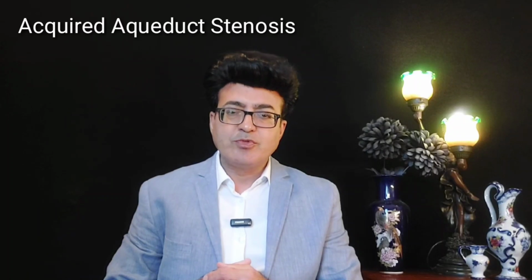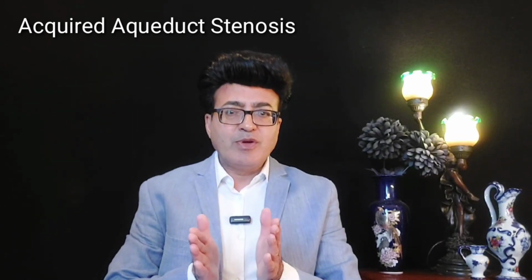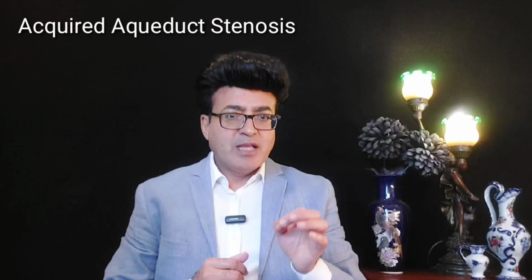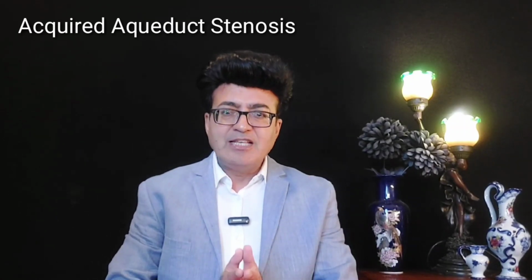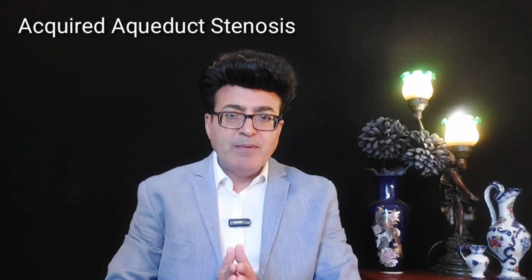you have to drain and reduce this intracranial pressure by ventriculostomy. Or you can also have another option available, that is called ventricular abdominal shunting. So you have to have ventricular abdominal shunting to take all this fluid out to release the pressure, and the patients will be normal. How will we be able to appreciate this on the CT imaging?